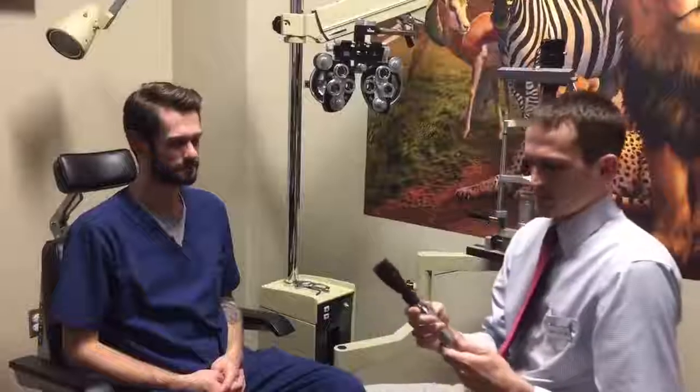What we're going to use for a child, and we're going to pretend that our patient here is a child, is this device. This is called a retinoscope, and it's an ingenious piece of manufacturing, in fact, because it lets us look into a patient's eyes and without them having to tell us anything at all, check to see not only if they need glasses, but also what their prescription would be. In a pediatric ophthalmologist's office, this is typically done with the eyes dilated because it's more accurate to check glasses that way for children. So we put in dilating drops, wait about a half an hour, and then we check.